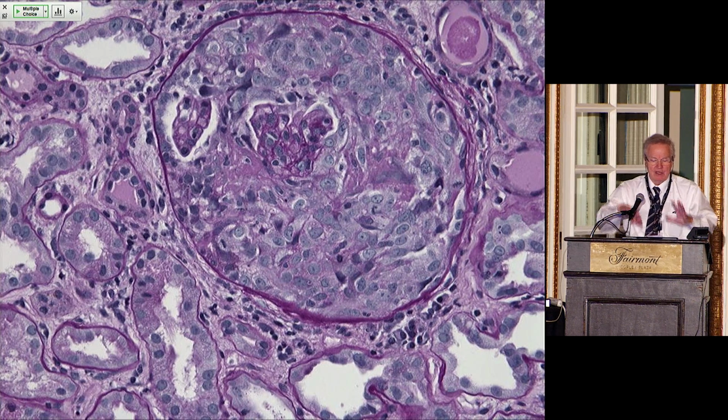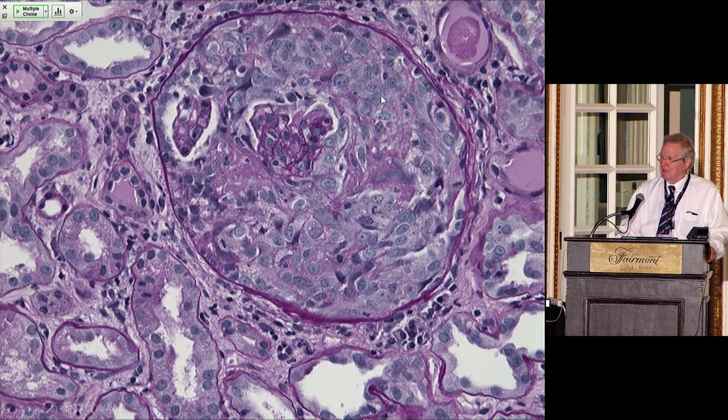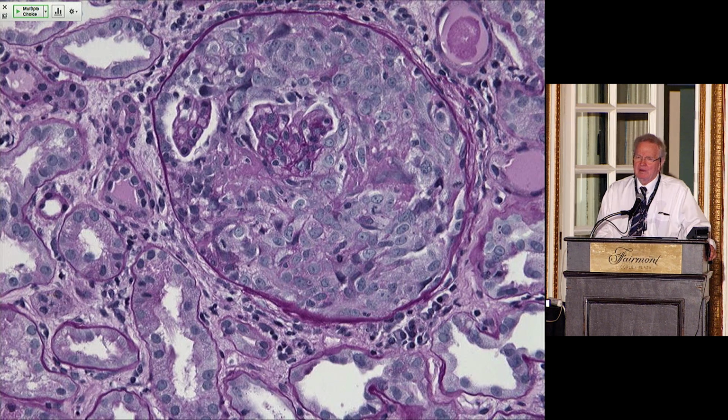Here you have a circumferential crescent that has completely injured and suffocated the tuft. You see, this is what is remaining of the glomerular tuft now, fragmented into 2 pieces. Focal necrosis here and a crescent here. Sometimes the crescents have multinucleated giant cells that tell you exactly that these cells are mononuclear derived. They are derived from the circulating monocytes that have become activated, and we call them epithelioid cells or multinucleated giant cells or just activated macrophages.